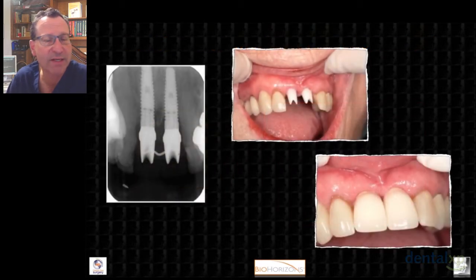And then we take a look at our second stage where we're placing our final abutments and provisional crowns, which we're going to give some time for the soft tissue to contour around these before the final restorations are made. And we've got some nice positioning, nice aesthetics, good tissue margins. Everything looks nice and healthy. And we would call this a nice result of placing immediate implants and now the final restoration, which was about to occur. And unfortunately, I didn't get final photos on this patient, but she did have a very nice result according to the GP.